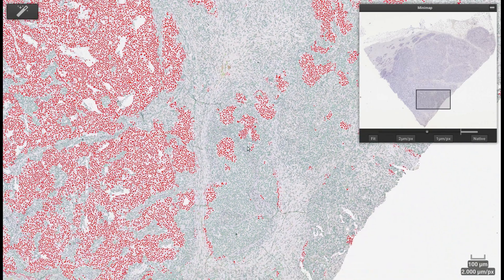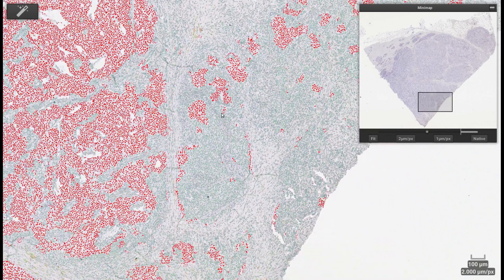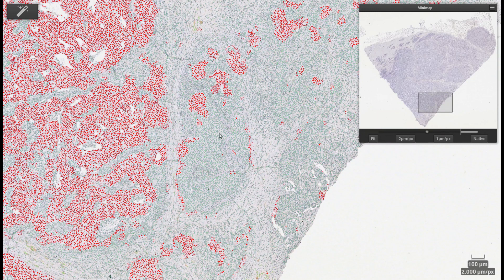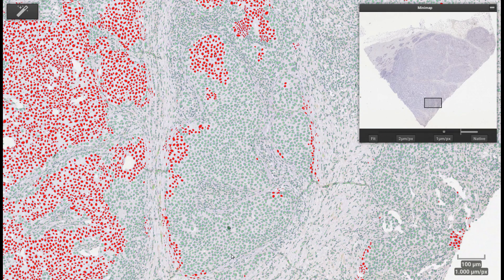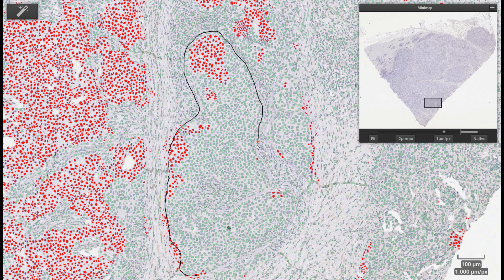The pathologists need to verify the proper detection and classification of the cells. When there are cells that have not been classified properly, those regions are just added to the training. To save pathologists time, the initial training of the system can be performed by a trained analyst.